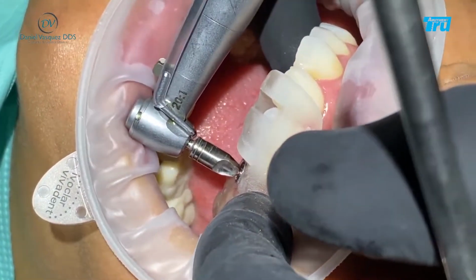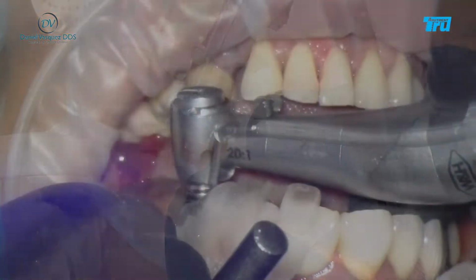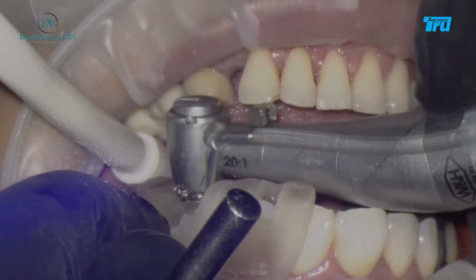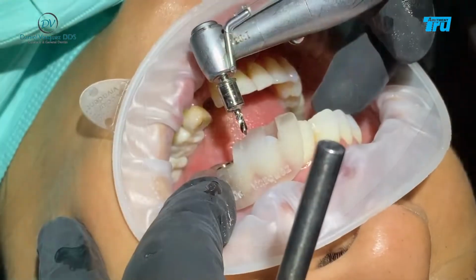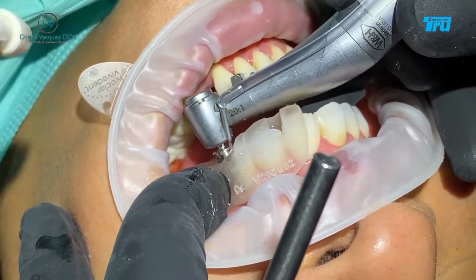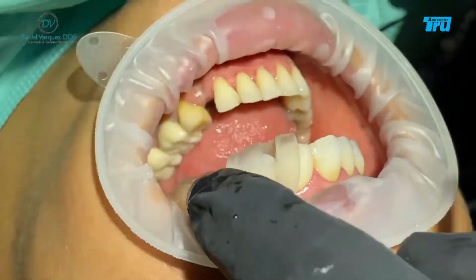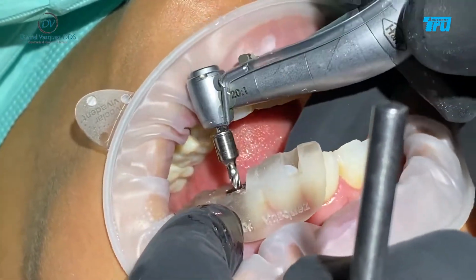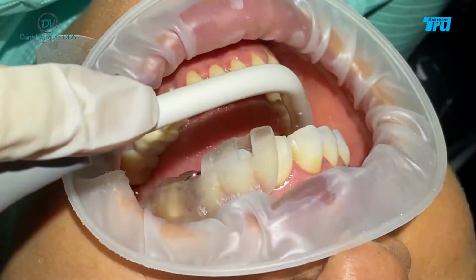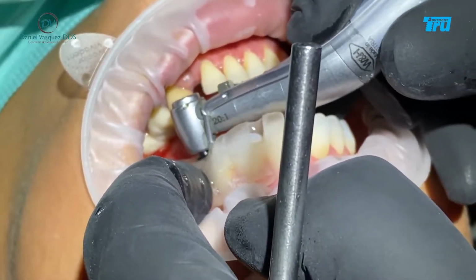So this is the flat drill. All we're gonna do is flatten the surface. Beautiful. Excellent. So this is the path drill. Perfect. The 2.6 path drill is a little bit thicker than the other one. Okay, excellent. Beautiful.